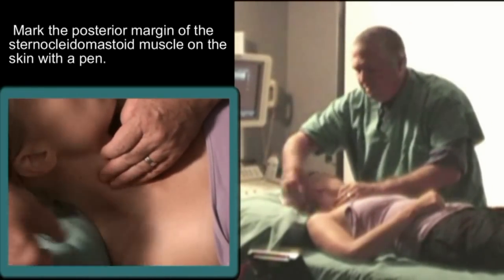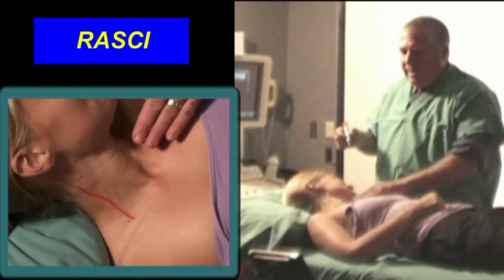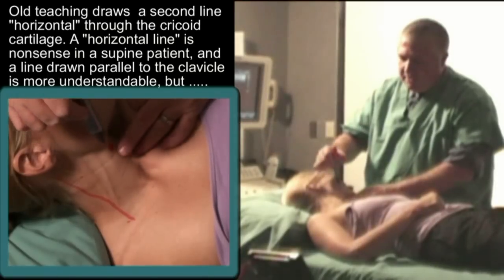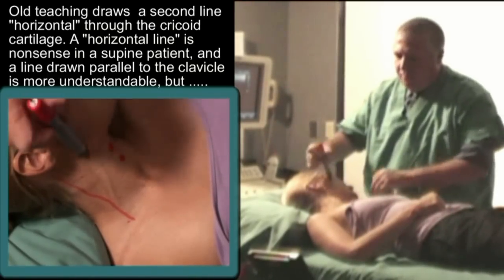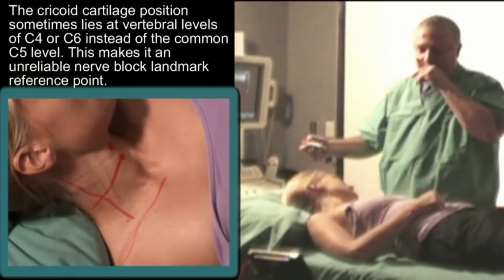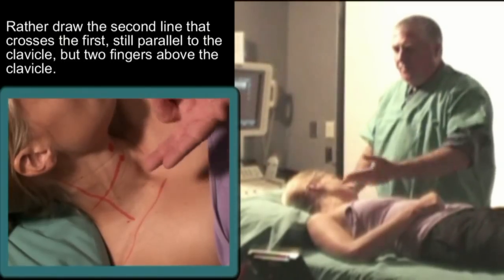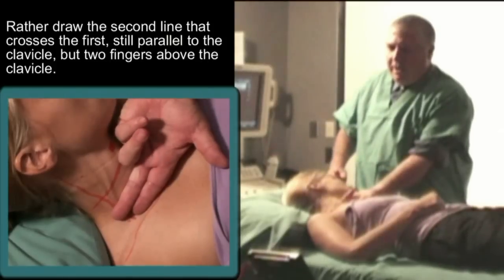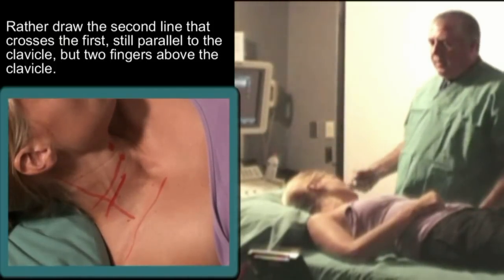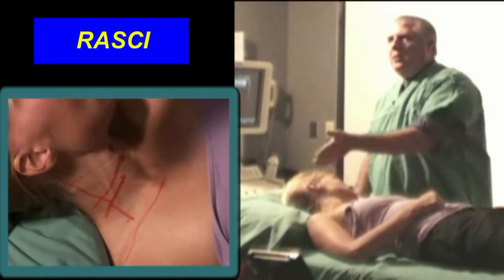So that's the margin I'm going to mark. I like to use bony points as reference points because they're more consistent. I just happen to know a two-finger breadth is kind of perfect. So I'm resting my hand on her clavicle. I'm measuring two fingers above her clavicle. And you'll notice it's a little bit lower than the one I calculated by classic prediction. Someone can have a short neck or a long neck. The variation in length is above this level. Length varies at the bottom.